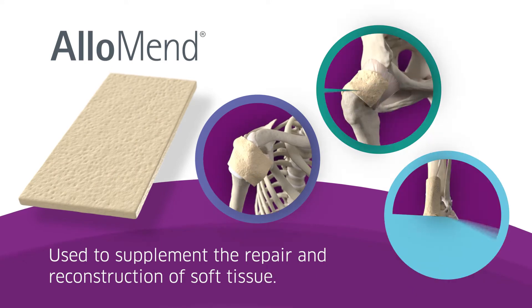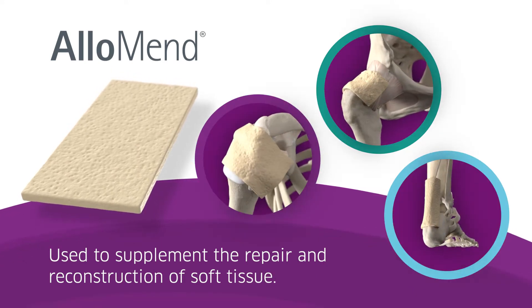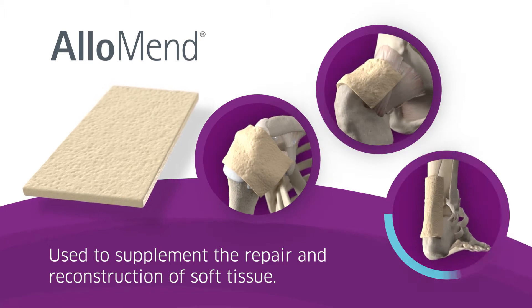These allografts are used to supplement repair and reconstruction procedures, including rotator cuff, hip capsule, and Achilles tendons.